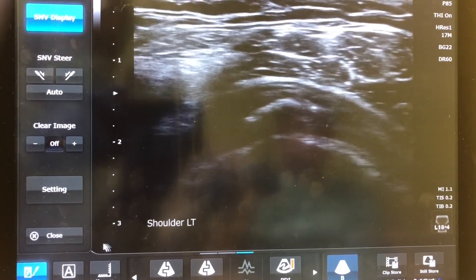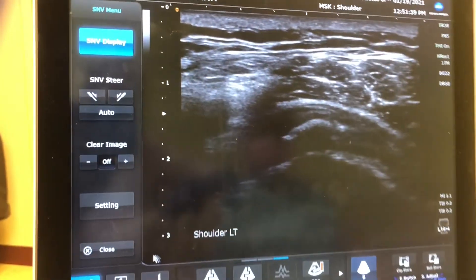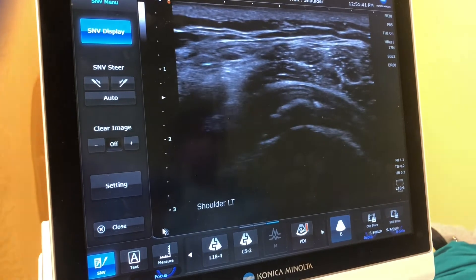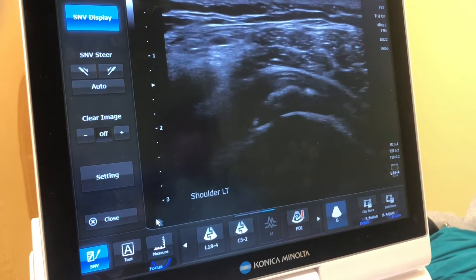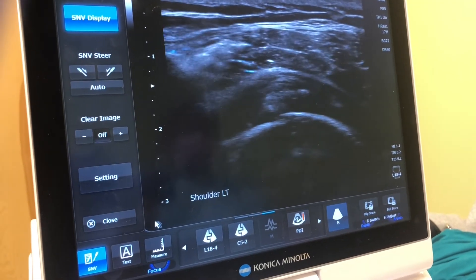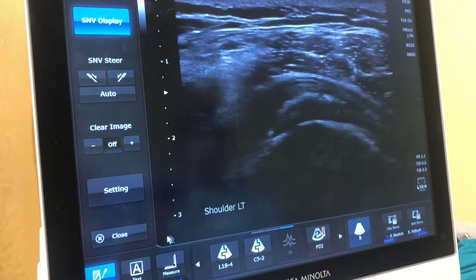After we have the patient positioned correctly and we identify the deposit on ultrasound, we numb the area with lidocaine using a 25 gauge syringe. We numb from the skin down to the calcification so the procedure is much more comfortable for the patient.